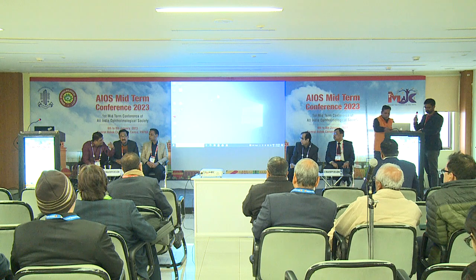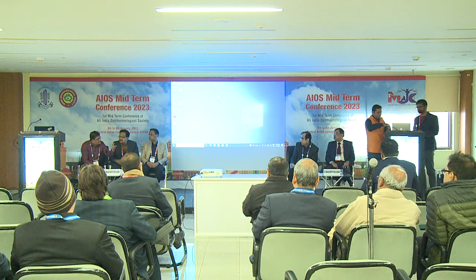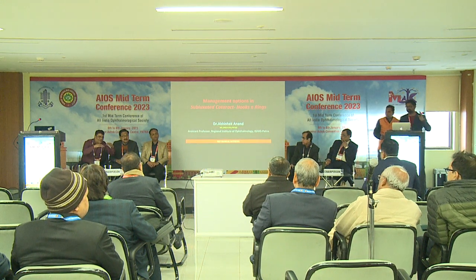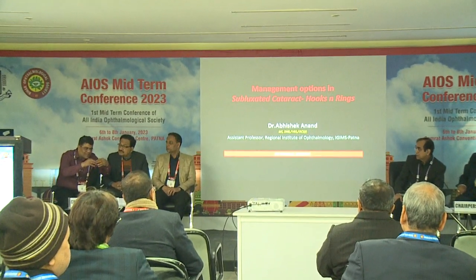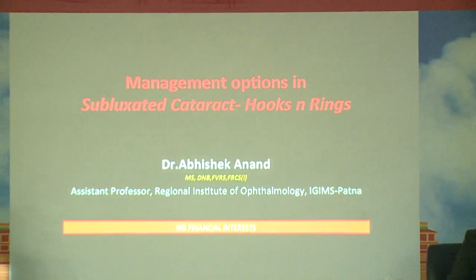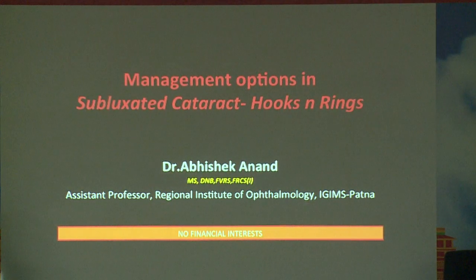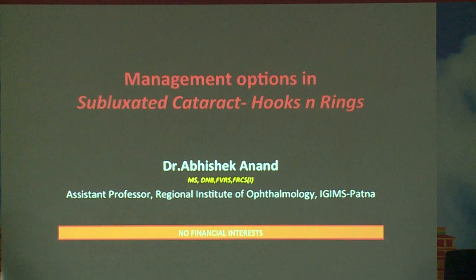Sugato mentioned the fluttering sign, no? But I've observed that it can only be seen once the nucleus is out. So once we have extension, the key is to maintain a closed chamber, because at that time we can't see the movement of the flap. Once some of the nuclear pieces come out, only then can we see whether it's fluttering. If it is not stained and you are trying to concentrate, then you can.